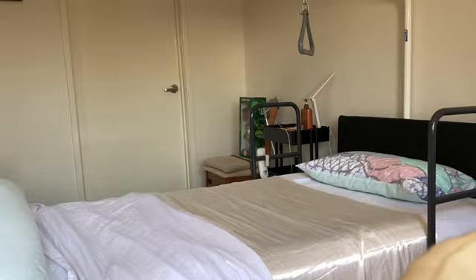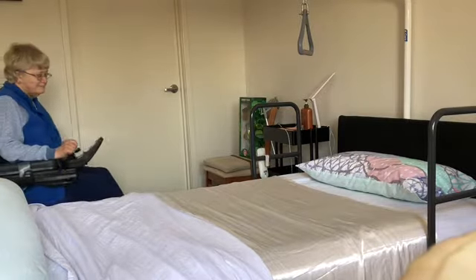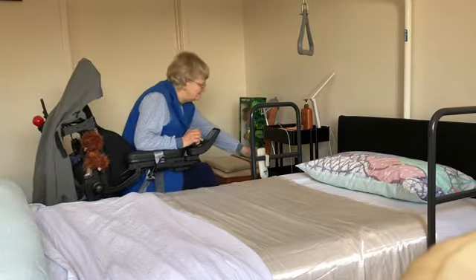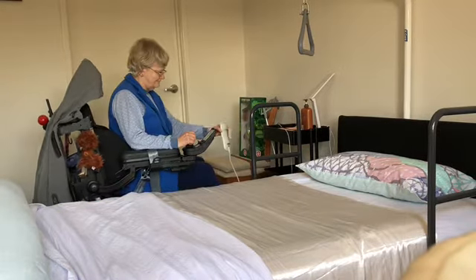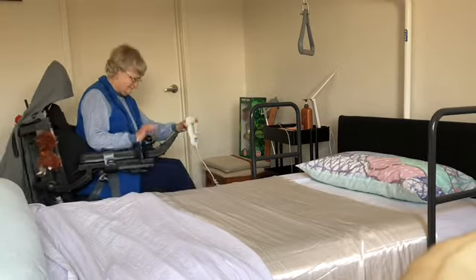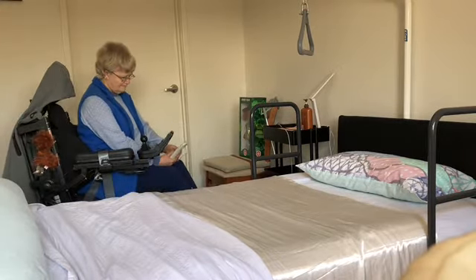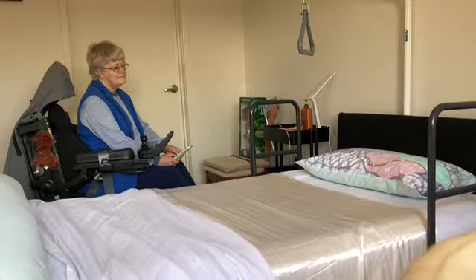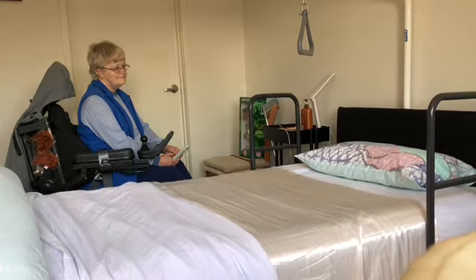This is the bed and I'll come in and show you what's here. I've got the controller and the first thing it can do is go up.